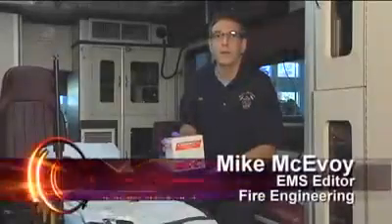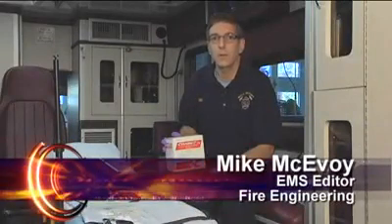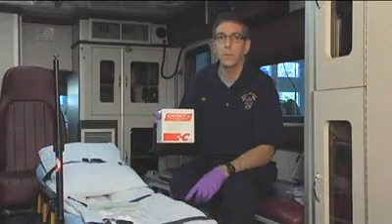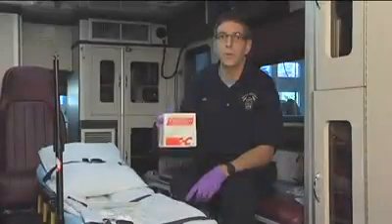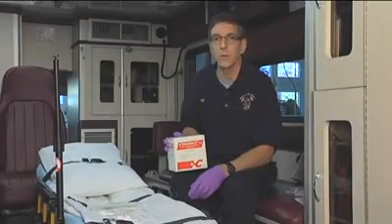Welcome to Training Minutes. Today I'm going to talk about how to set up and administer a Cyanokit, a cyanide antidote kit, used by firefighters and EMS providers who treat victims pulled from a structure fire with smoke inhalation who are in extremis, or as we would say, serious condition.